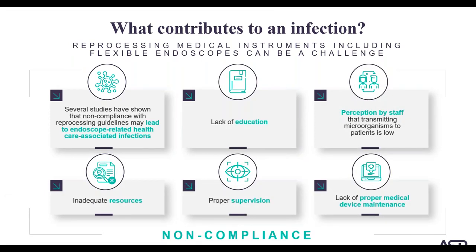In 2015, the FDA released a safety communication titled Infections Associated with Reprocessed Flexible Bronchoscopes and identified missteps when reprocessing these devices. The missteps included lack of pre-cleaning, also known as point-of-use cleaning, failure to perform thorough cleaning, failure to brush or flush all the channels, use of expired detergent or high-level disinfectant, insufficient flushing, rinsing, or drying.